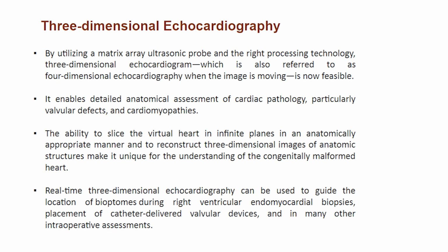The ability to slice the virtual heart in infinite planes in an anatomically appropriate manner and to reconstruct three-dimensional images of anatomic structures makes it unique for the understanding of the congenitally malformed heart.